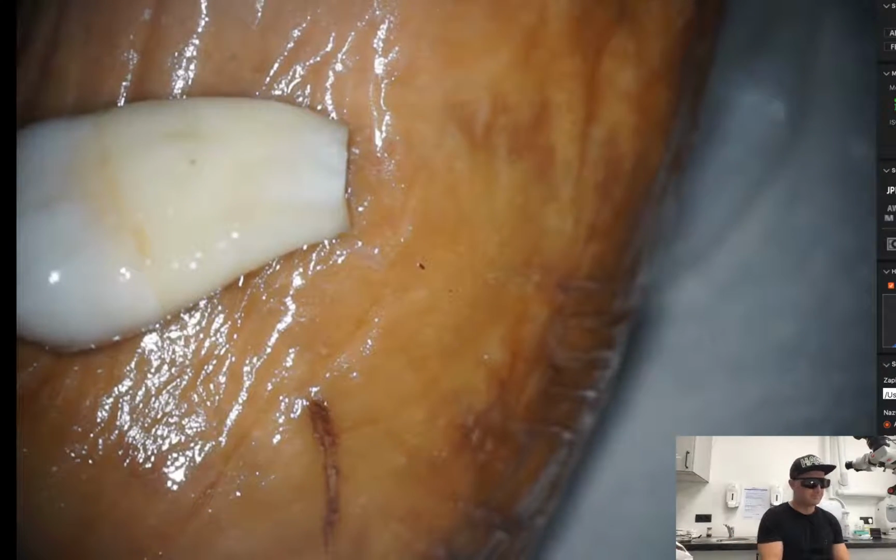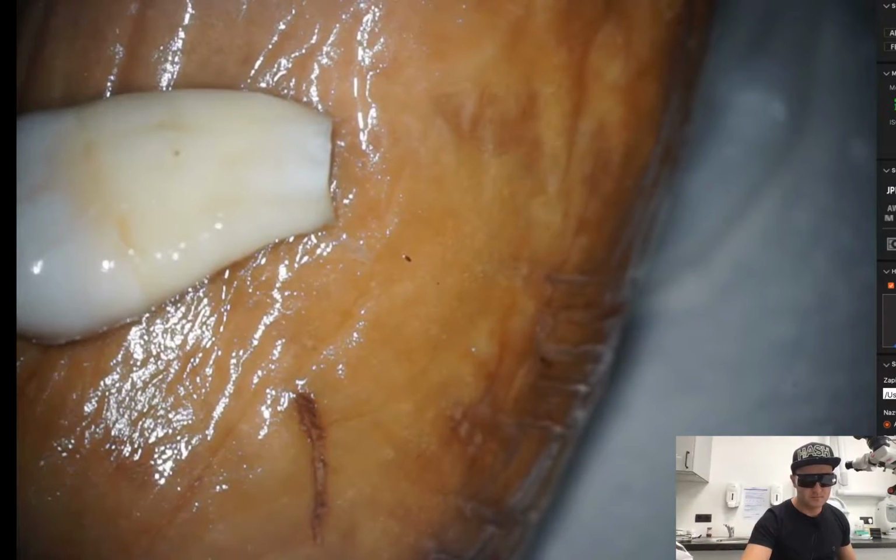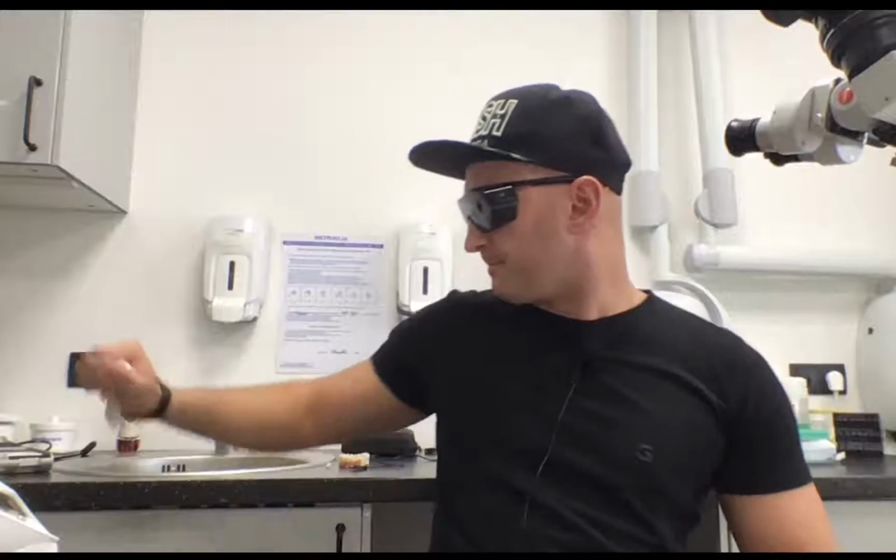What is very important here in this case? So I think I showed you all the basics you need to know to start to work with erbium YAG laser. So you need to remember erbium is for hard tissues and for soft tissues, but there are some differences.